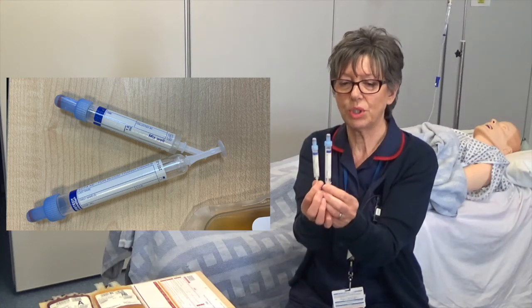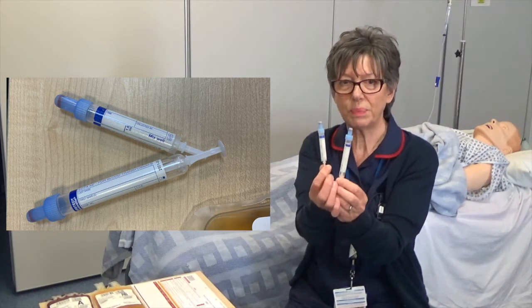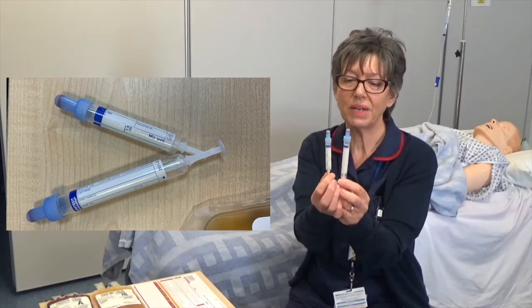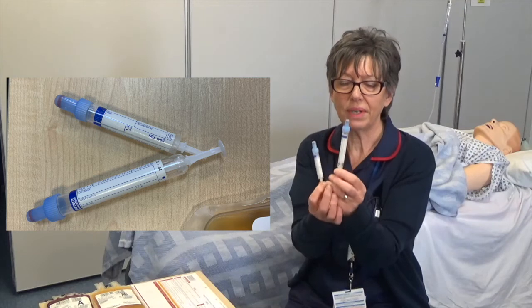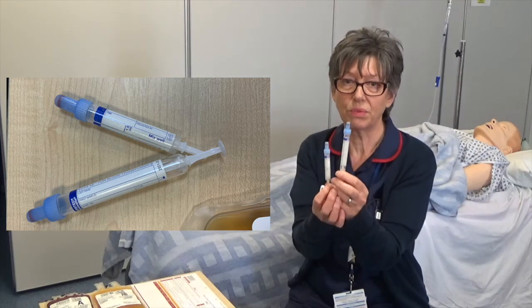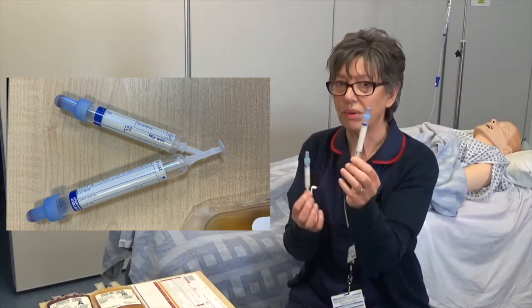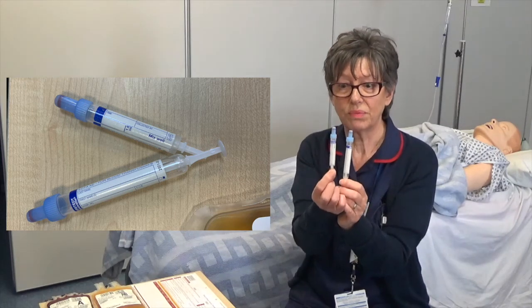You can see I've got two here. One's adult and one's paediatric. We will accept in the laboratory a paediatric sample if you are having great difficulty getting some blood from a patient. But preferably the big one for adults. Obviously the smaller one for paediatrics. Okay.